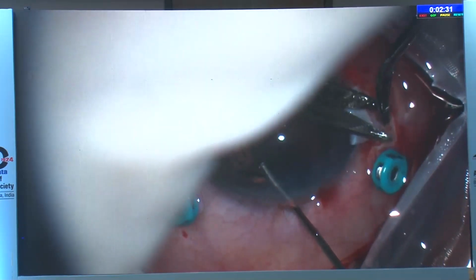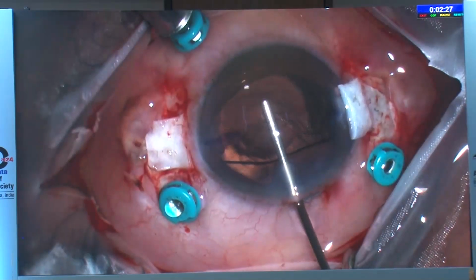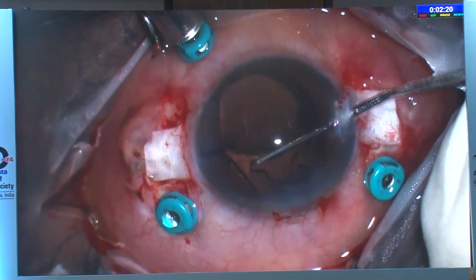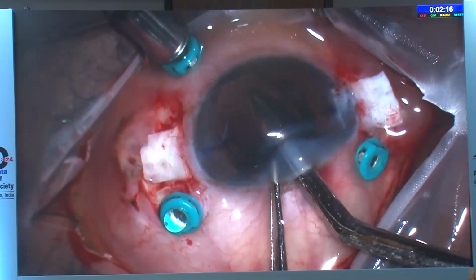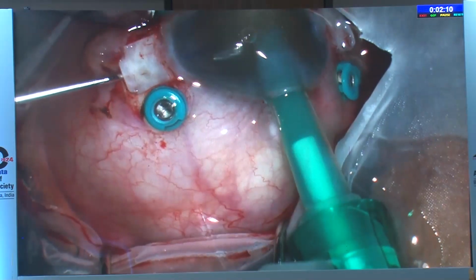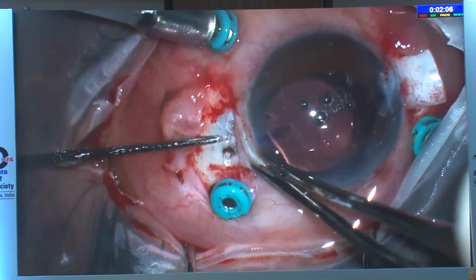Again, because it is a hydrophilic and foldable lens, it's not so difficult. We don't have to extend to a tunnel and everything. You can just rotate it, cut the lens and bring it out through the same opening which we have made, and place a new lens through the same section. This time being more careful.